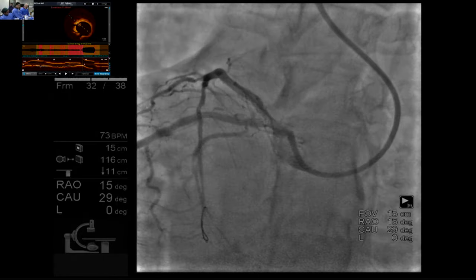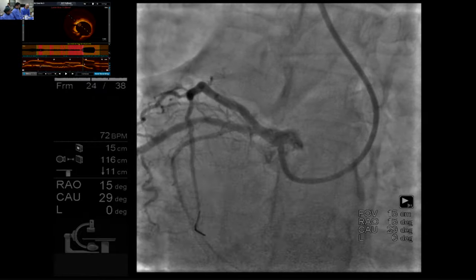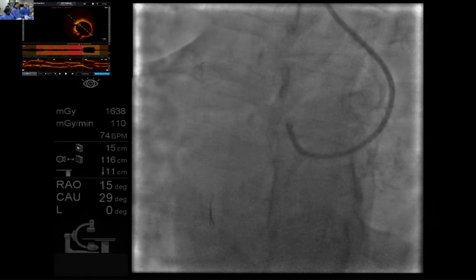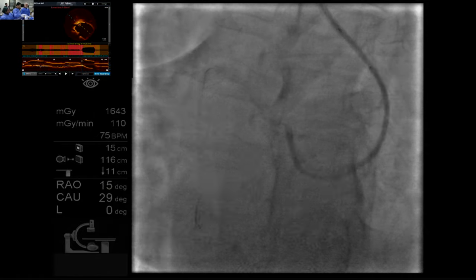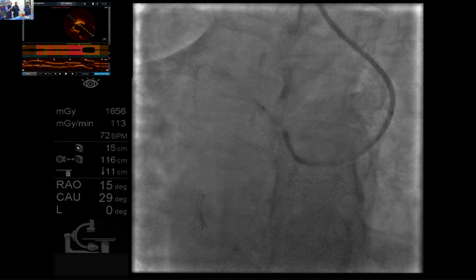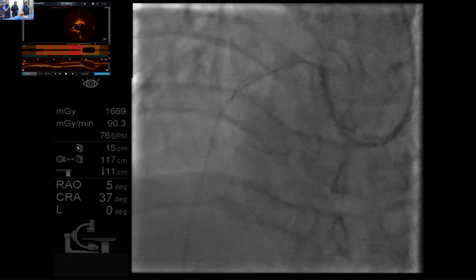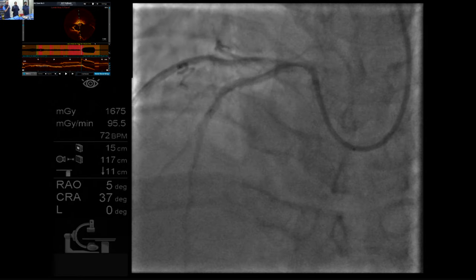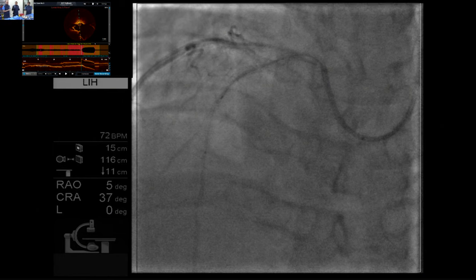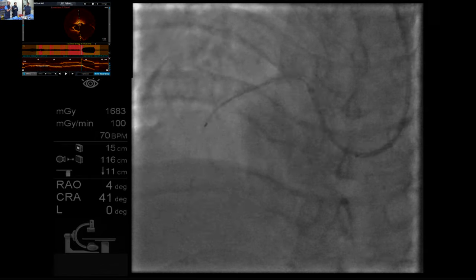We don't give so many runs of OCT because this is a discussion in an academic course. Just as a panel, the strategy TJ is using is to pull the stent back, a couple of stent struts back to the left main, so he can cover the dissection without compromising the circ. Okay. Go to AP cranial. In the panel, how many of you will cover the whole left main, do a provisional, or how many will agree with that? It's a good question, TJ's approach. Very good question. Go to RAO caudal. How many percent? Yeah, how many of you?